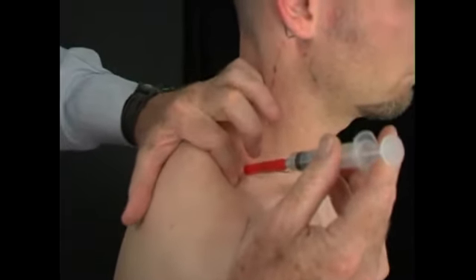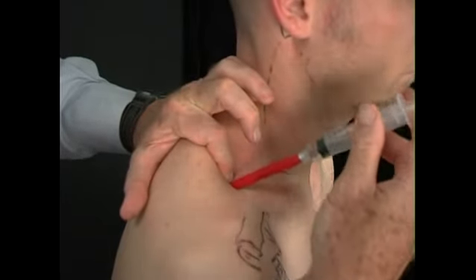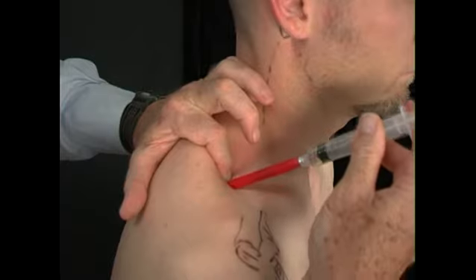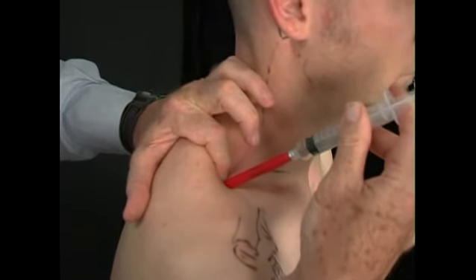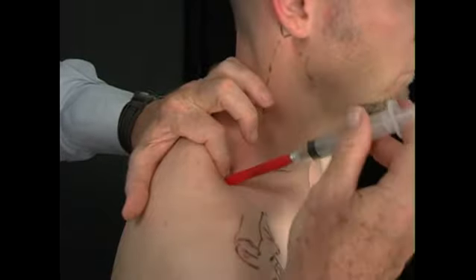We then just drop off it, and we're on the first rib, and so our injection here again is toward the back dorsally and caudally, coming down onto the first rib to avoid the apex of the lung that would reside in this area.